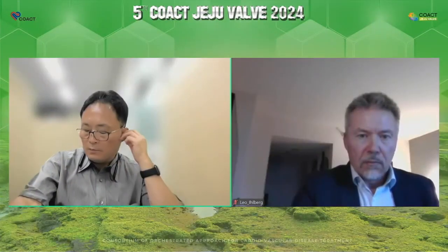Thank you very much. I don't perform post-dilatation for all of the cases. I perform post-dilatation only for the mild to moderate PVL cases, right?